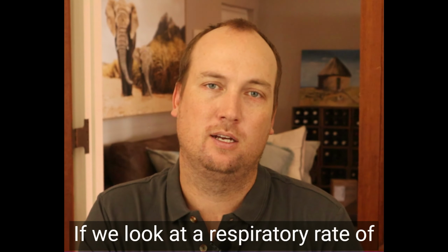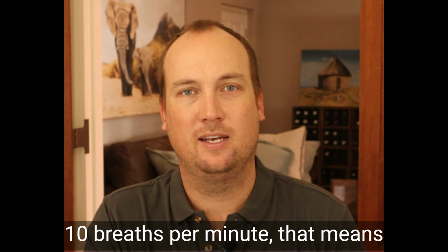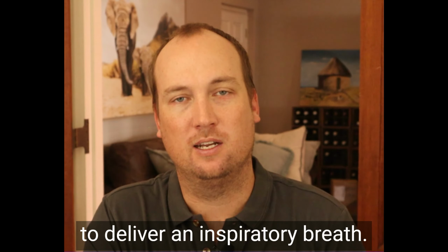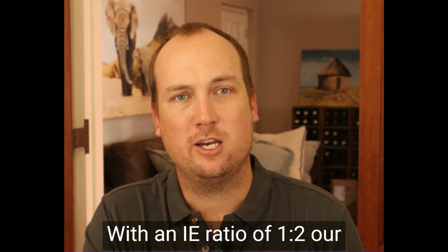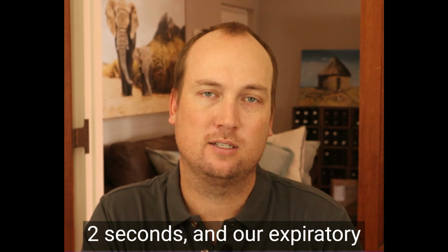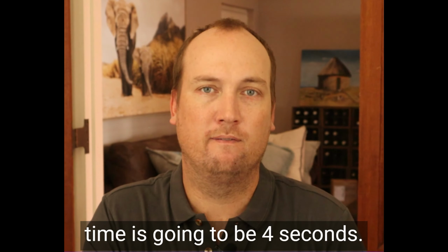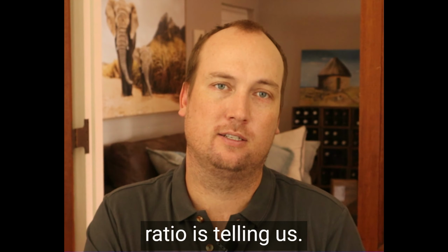If we look at a respiratory rate of 10 breaths per minute, that means every 6 seconds we are going to deliver an inspiratory breath. With an IE ratio of 1 to 2, our inspiratory time is going to be 2 seconds, and our expiratory time is going to be 4 seconds. That is what the IE ratio is telling us.